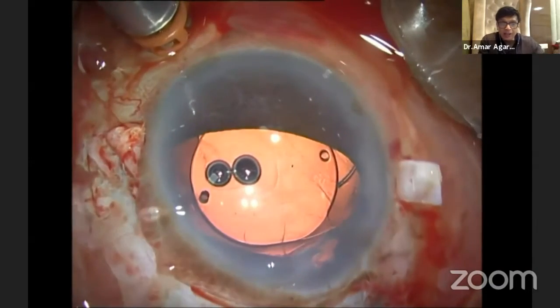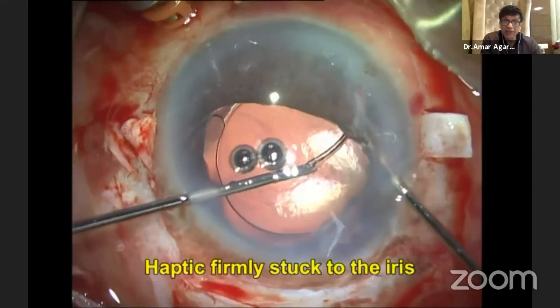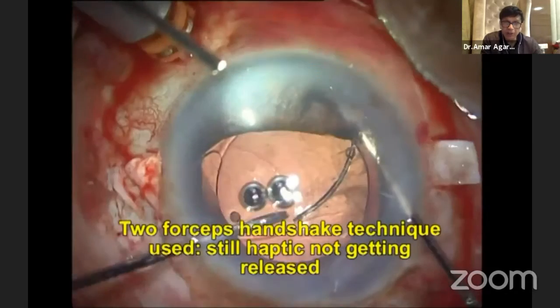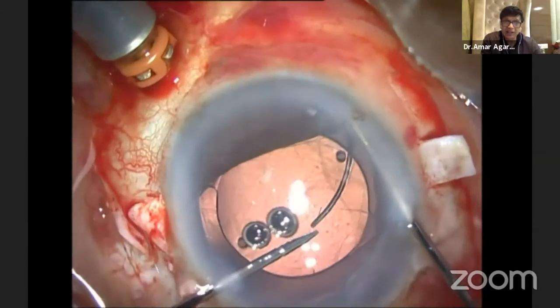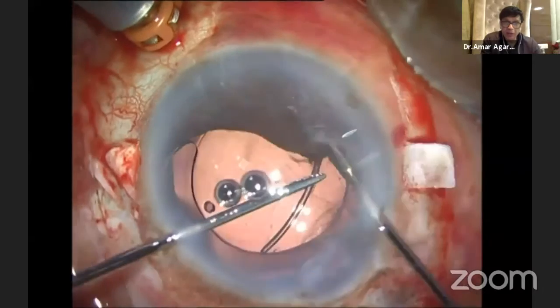Now I'm in a situation where I have no other choice but to explant the IOL. I'm using two hands and I'm trying to explant that IOL haptic. It's just not coming — it's so firmly stuck. Imagine putting a PC IOL in the AC. This shows how wrong the technique would be.